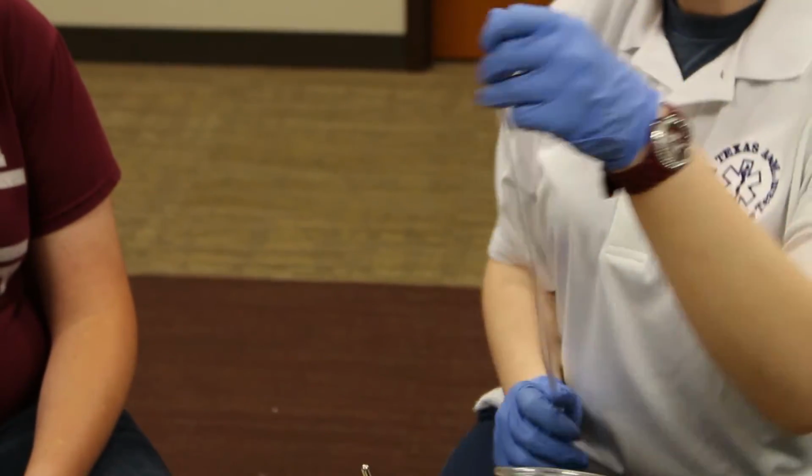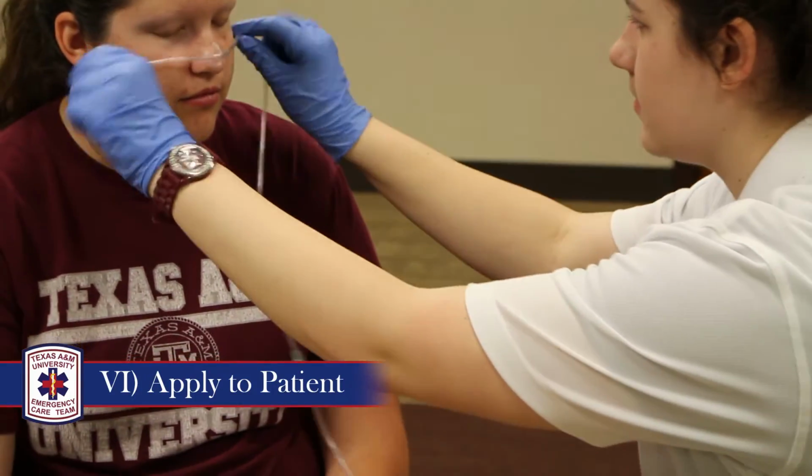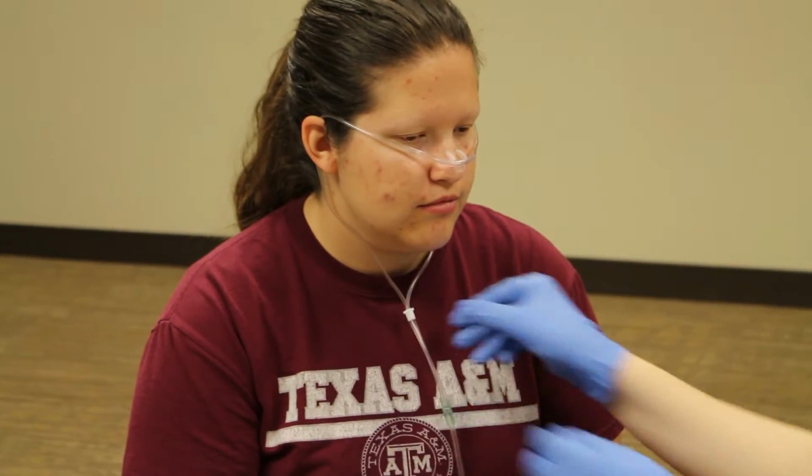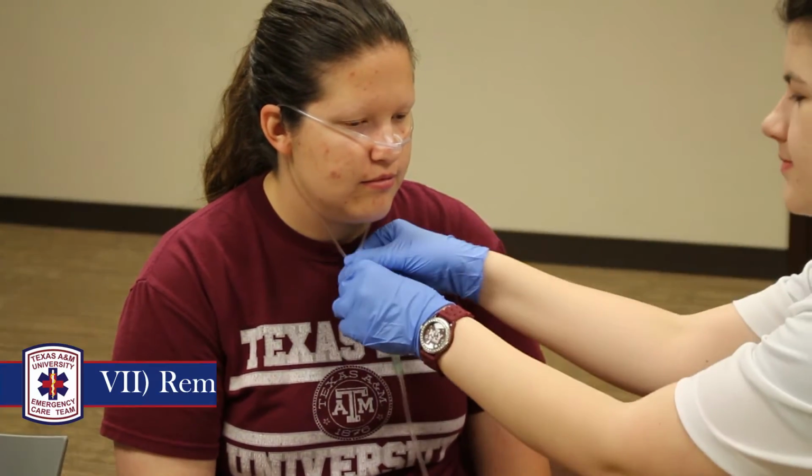Apply the nasal cannula to the patient with the prongs facing down, wrapping the tubing around the ears and tightening around the neck. To remove, follow the directions in reverse.